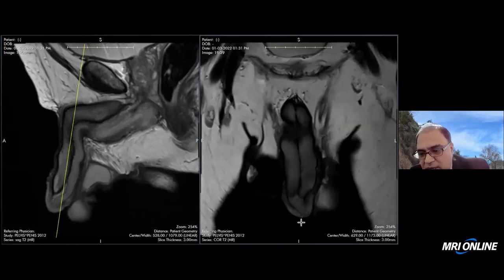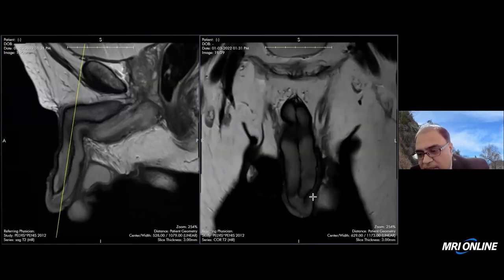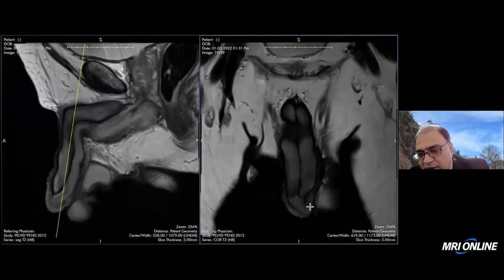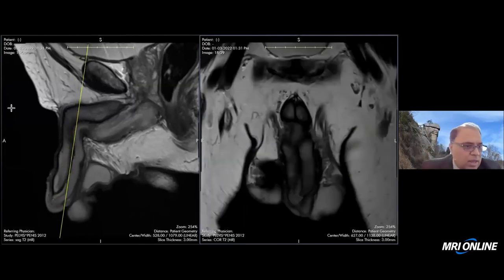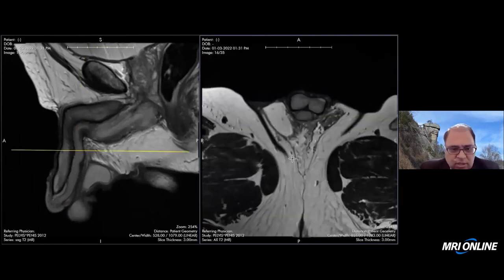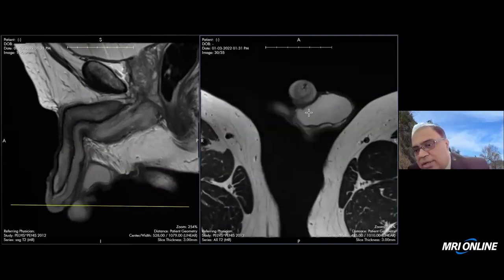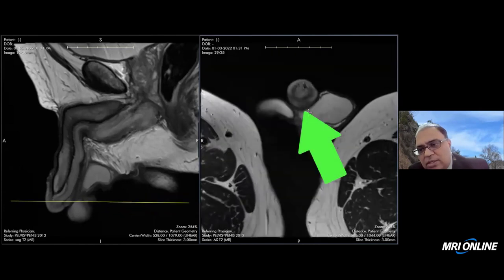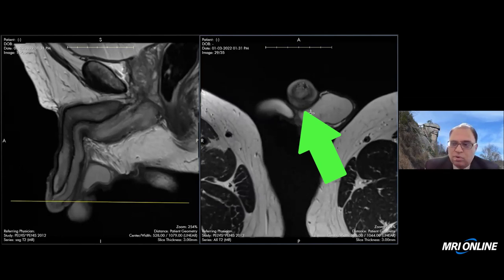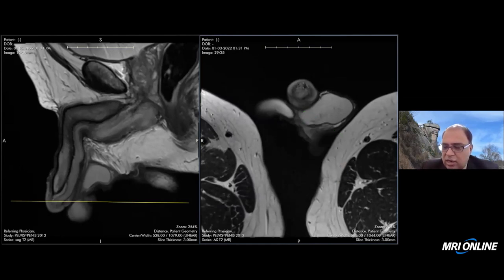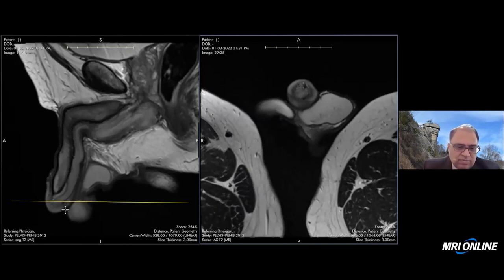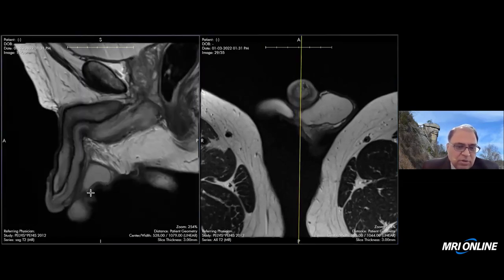I'm not seeing any lesion per se on coronal. The glans penis there is looking just fine. Moving to axial images to find this area — I'm not seeing a mass anywhere, but I'm seeing irregularity and hypointensity involving that area, which corresponds to the known mass based on the clinical notes. These findings are consistent with the known carcinoma in situ, but we did not see any mass in this particular case.